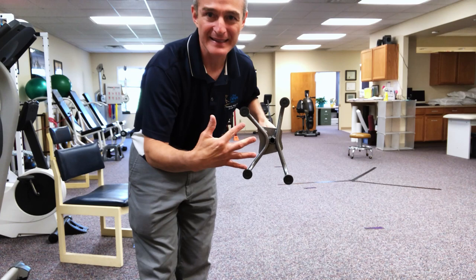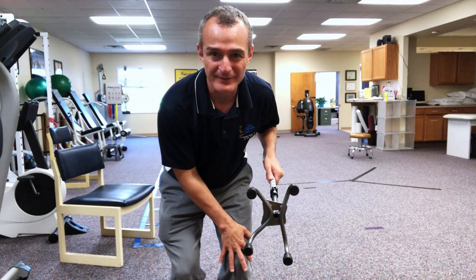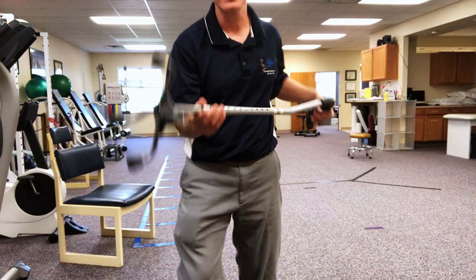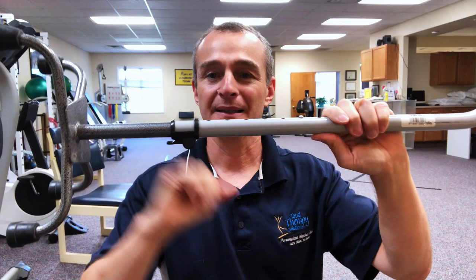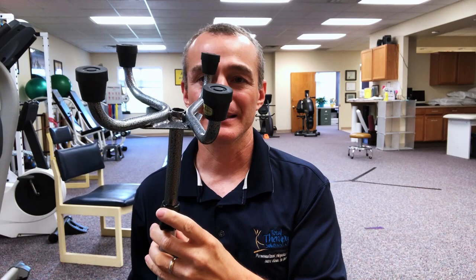Notice one side of the quad cane base is straight across and the other side juts out a little. If I had a knee replacement on the left knee and want to use the cane in the right hand, I need to orient it correctly. There's a little clip — I unclip it, pivot the base, let the spring-loaded pieces pop back out, and lock it in place. Now I have a right-handed quad cane.